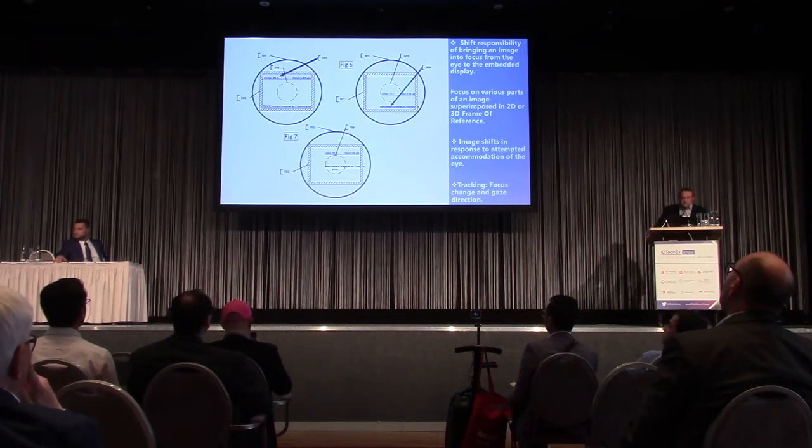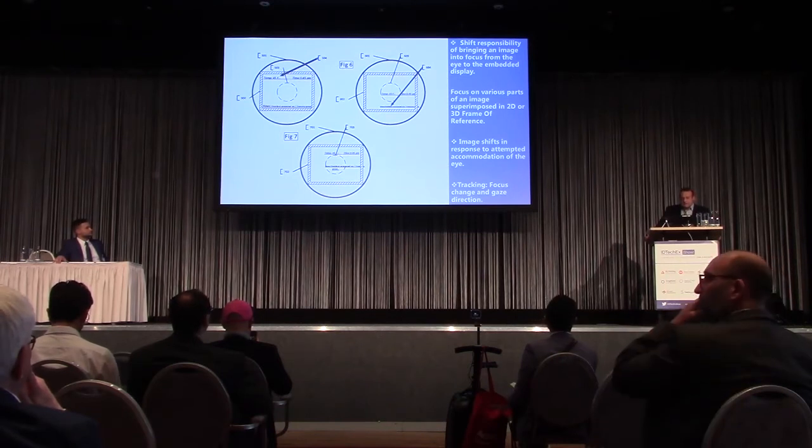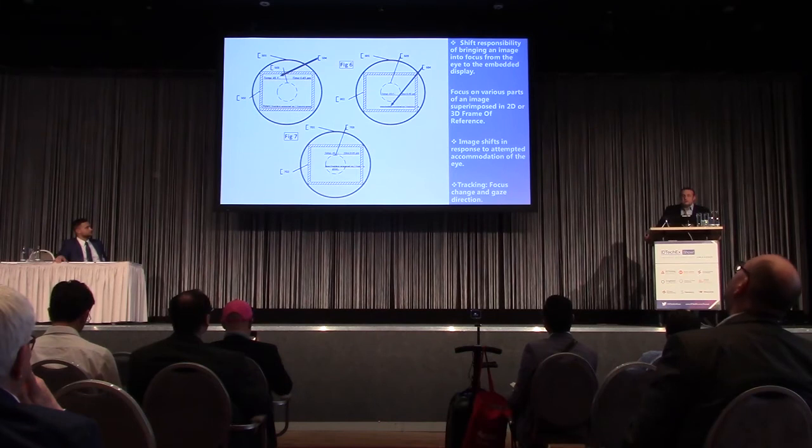In figure 5, this is the pristine initial view. The user wearing this contact lens has a temperature indicator in the upper left corner, a timer in the upper right corner, and below, in peripheral view at the bottom of the display, there is a running news line that is constantly updatable.